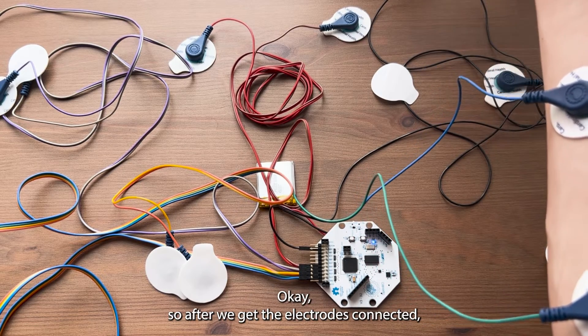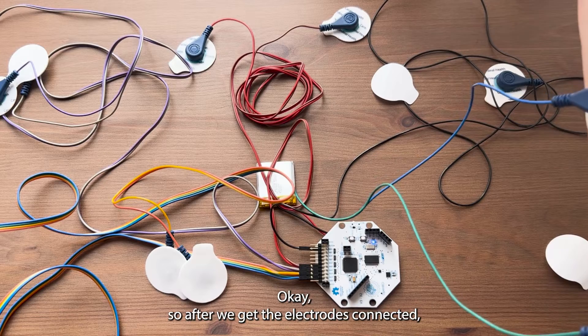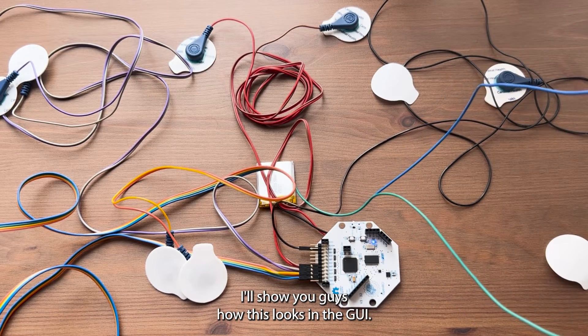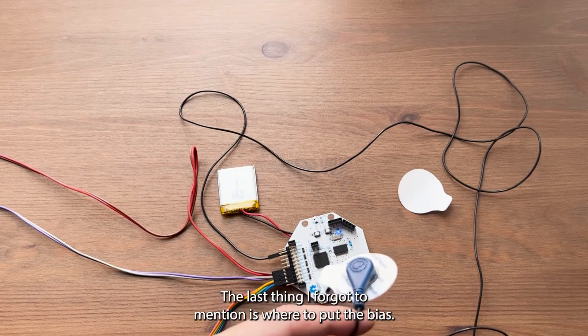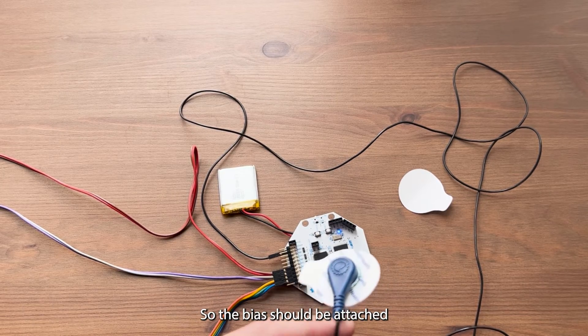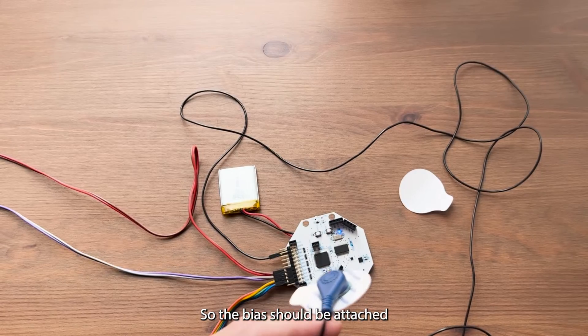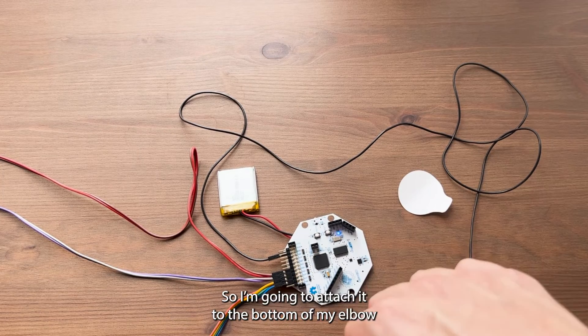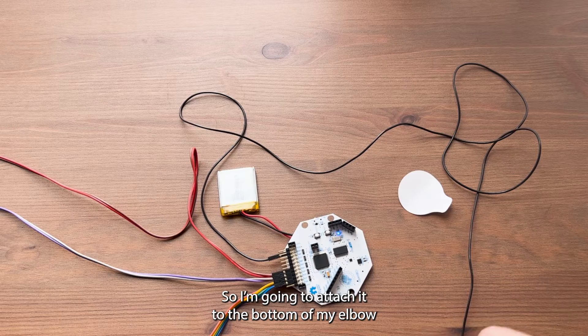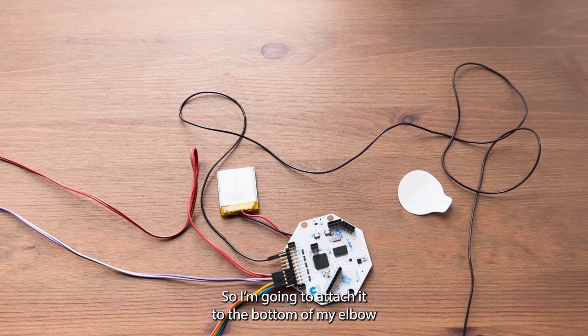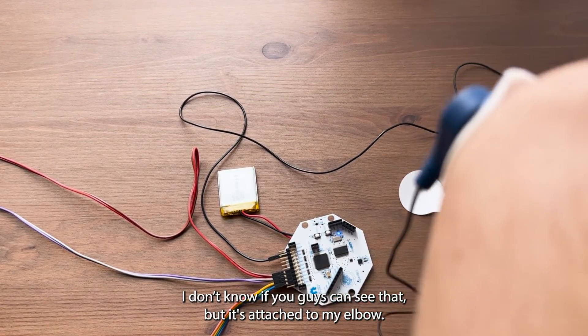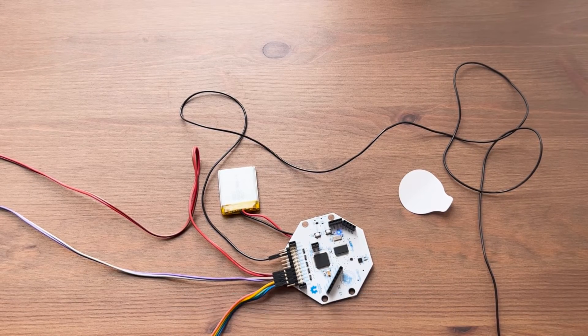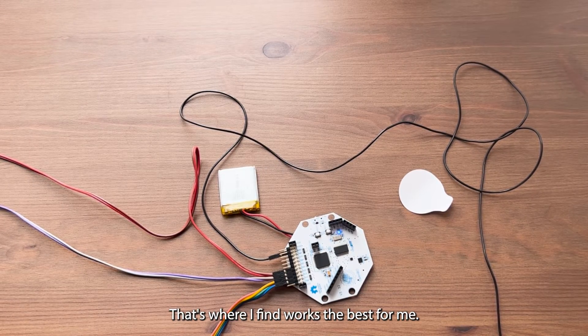After we get the electrodes connected, I'll show you how this looks in the GUI. The last thing I forgot to mention is where to put the bias. The bias should be attached to a bony part of your body where there is not much muscle activity. So I'm going to attach it to the bottom of my elbow. I don't know if you can see that, but it's attached to my elbow. That's where I find works the best for me.